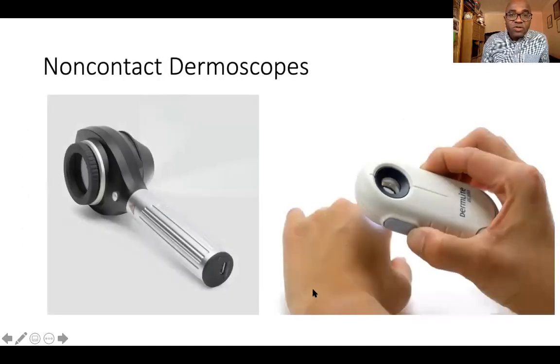So this is a non-contact dermoscope. Non-contact literally means you use a dermoscope to magnify the lesion, but the dermoscope does not touch the skin or the lesion.